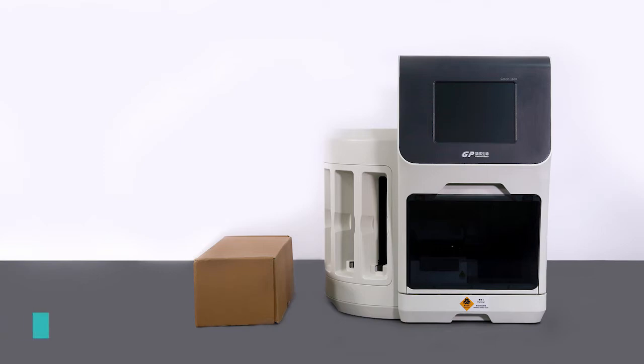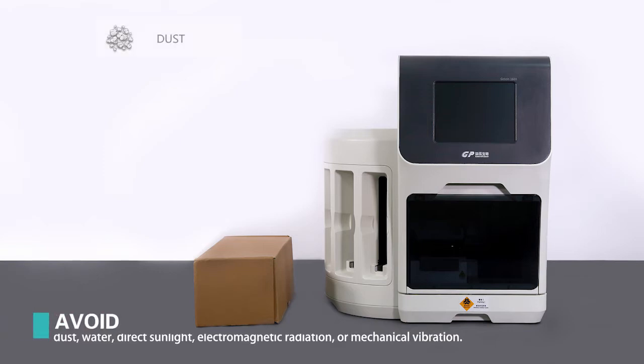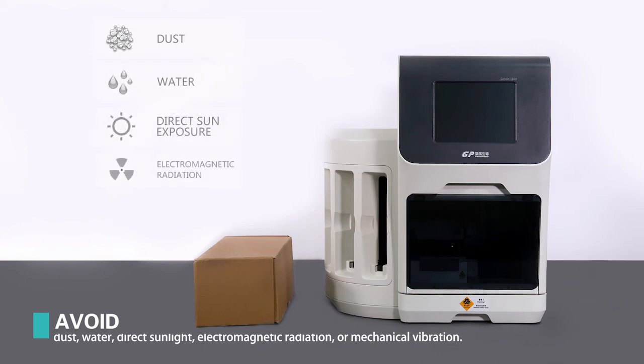Avoid placing the instrument where it may be exposed to dust, water, direct sunlight, electromagnetic radiation, or mechanical vibration.